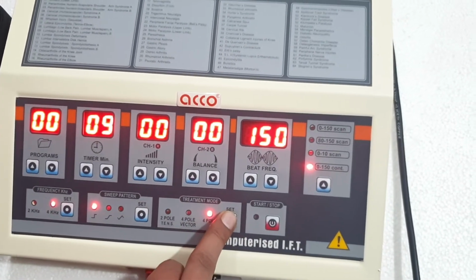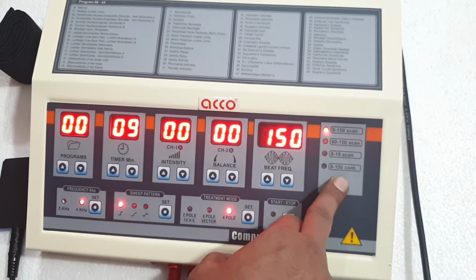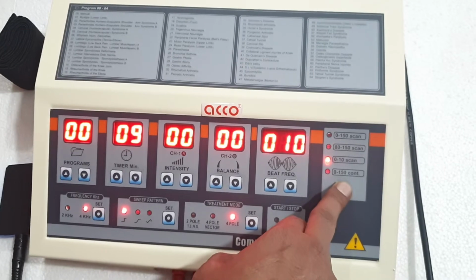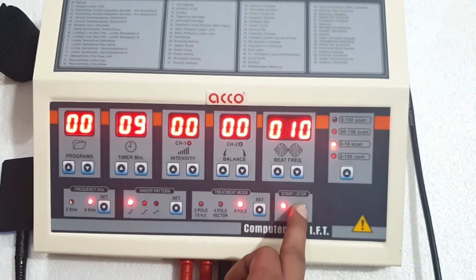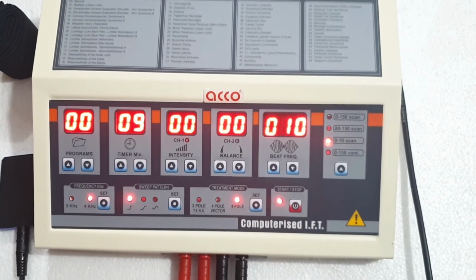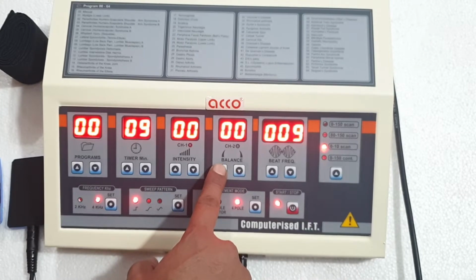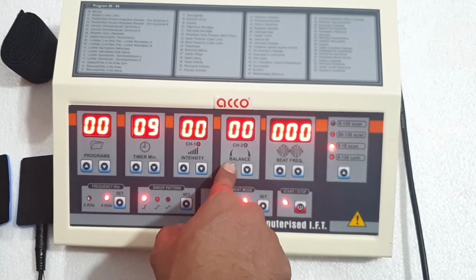Let's start on 4 pole. After setting the parameters, start the machine. You can change the balance of the channel 2 from this.